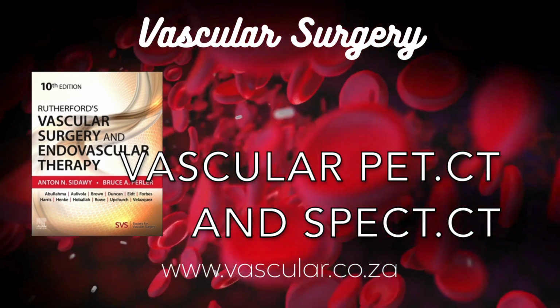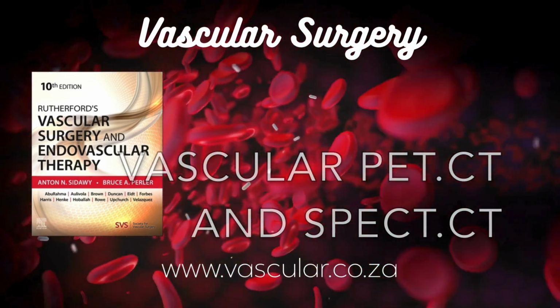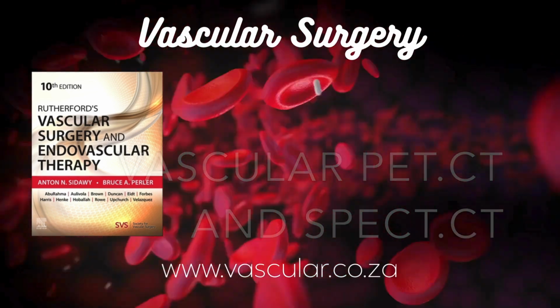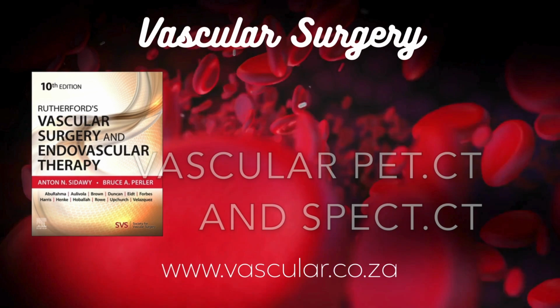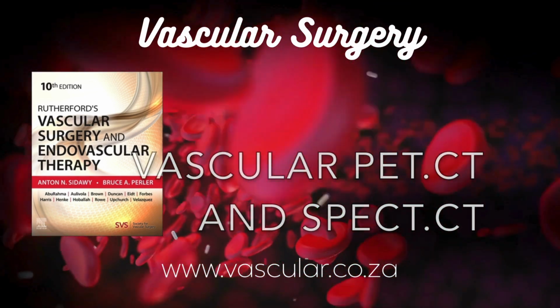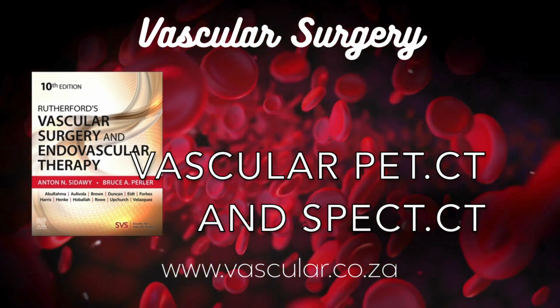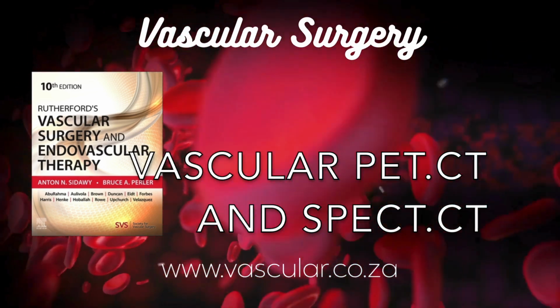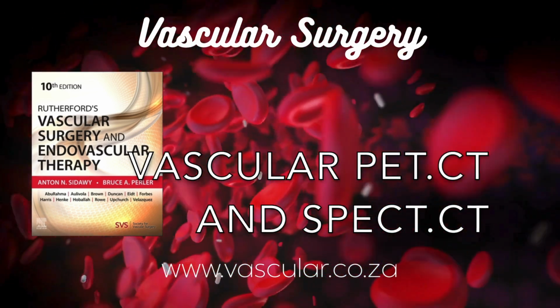Okay, let's shift gears. How are these techniques actually being used now in clinical practice, or close to it, for specific vascular conditions? Let's start with atherosclerosis, the big one. Right. Atherosclerosis, plaque buildup. FDG-PET has given us some really valuable insights here. Studies have shown, for instance, that FDG uptake increases in the carotid arteries, the big ones in your neck, with age, in men, and in people with traditional cardiovascular risk factors. Like high blood pressure, high cholesterol. Exactly. It links inflammation, as detected by FDG, with known risk factors.